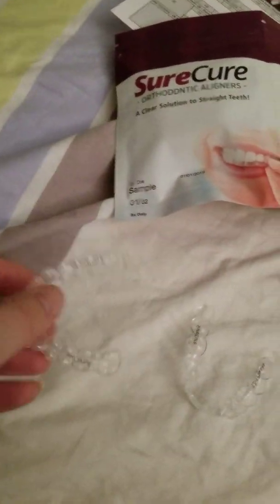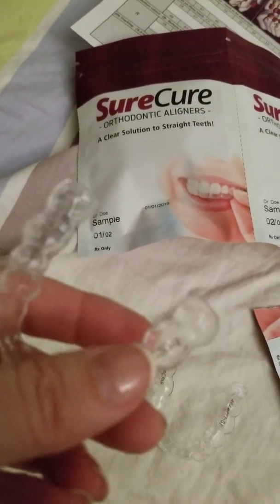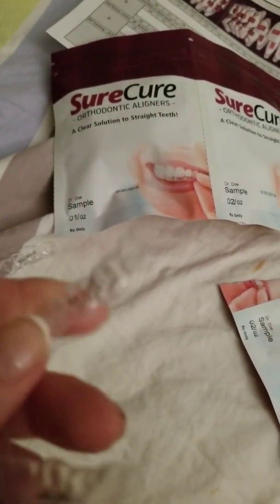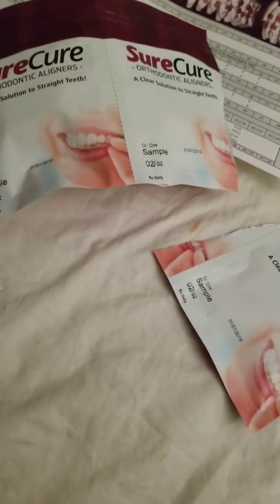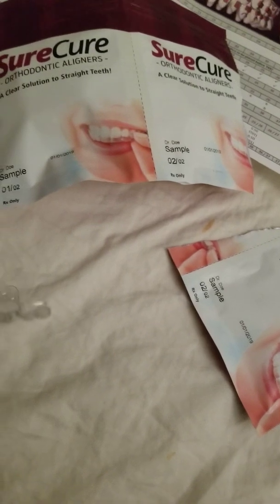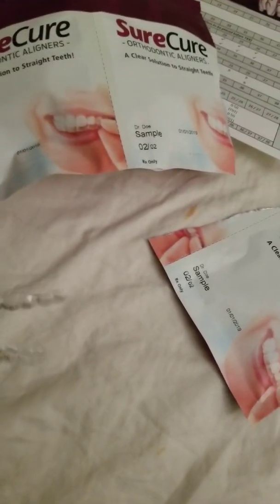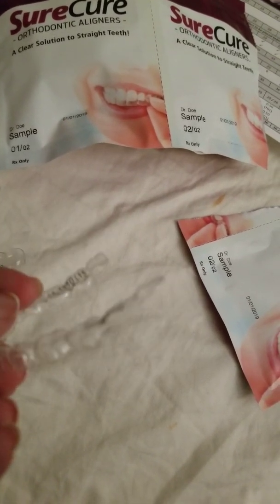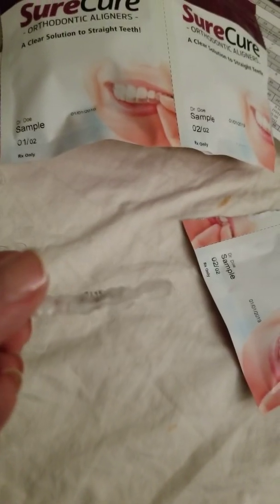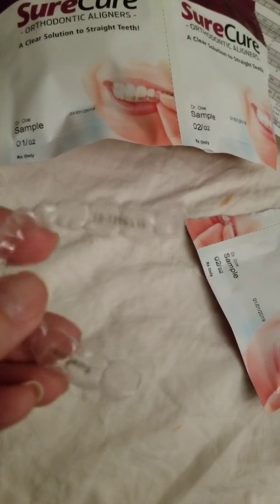What do they feel like? Oh, this is pretty standard stuff. Boring, but stable. I like the trim. I'll give them that. The trim is pretty cool. You don't see a lot of this. This is really short scallop trim. Wow. Super thin. You don't see a lot of this. It's kind of Invisalign-y. It's definitely not like ClearCorrect trims or anything like that. It just seems awful trimmed. But yeah, I think this is probably Zendura. That's what it feels like, but I'm not totally sure. But yeah, that's pretty much it.